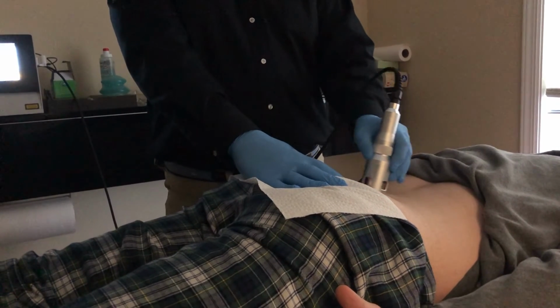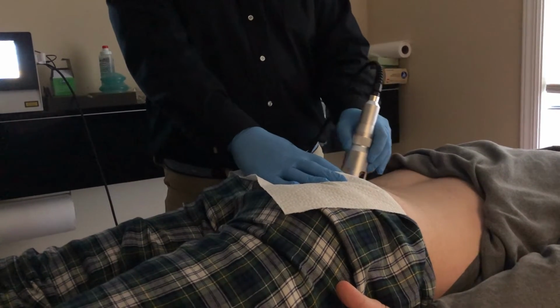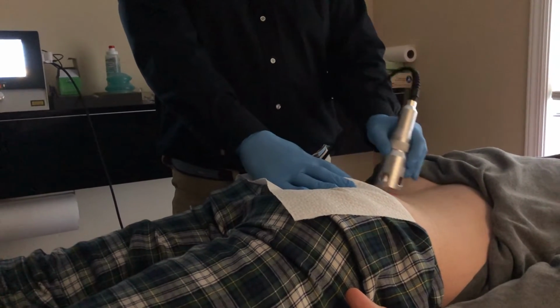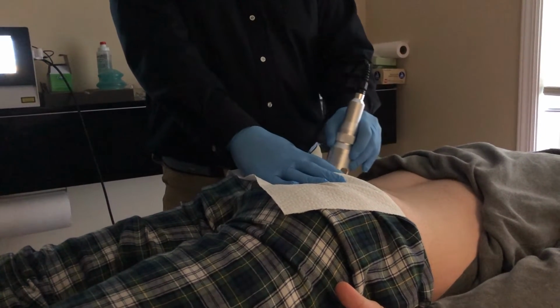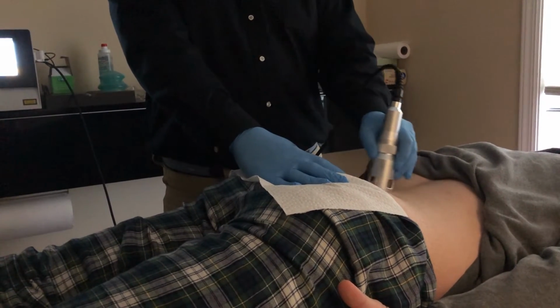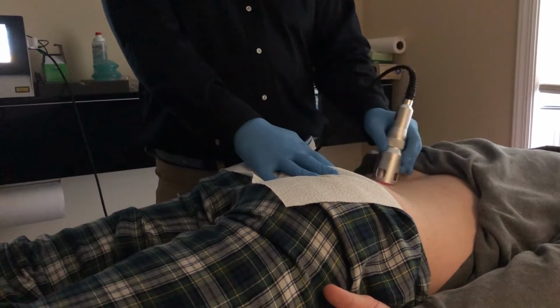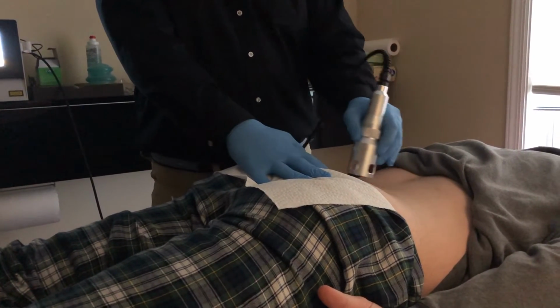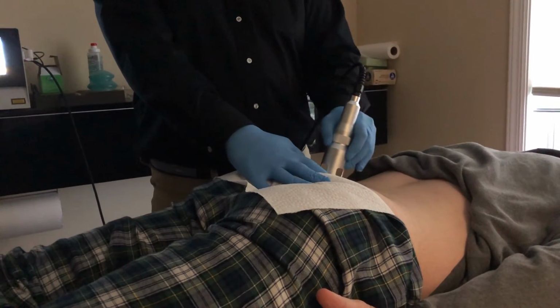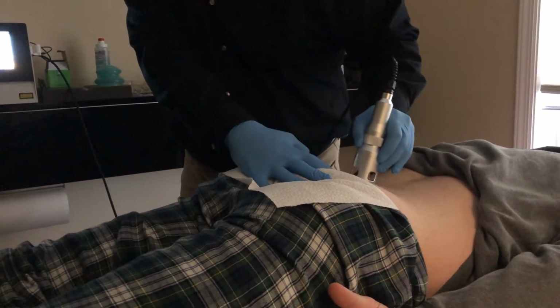So we're using low-level laser light therapy, again, not just to stimulate production of ATP and the water molecules for microcirculation. What we're also trying to do, very simply, is offer pain relief. If you can understand the concept of photosynthesis, we're using light energy to accomplish our goals on the cellular level. Now, as you can see, there's really no pain involved. We're barely touching the surface of the skin. The skin's been prepped, and we do this for approximately another minute and a half.